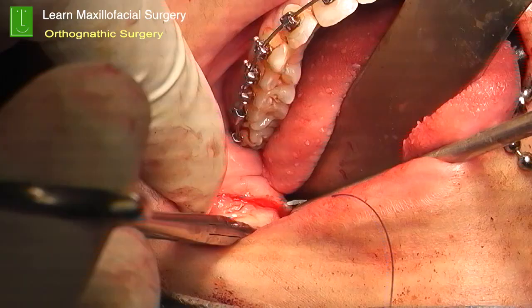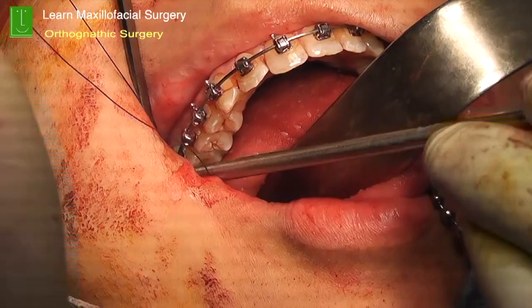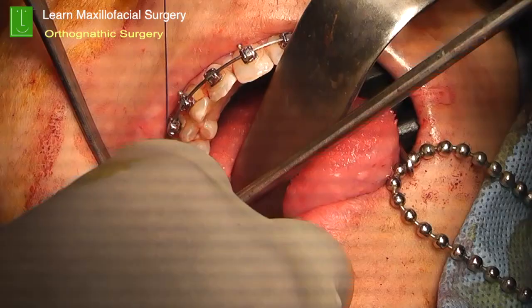Once you are happy with that, then essentially you bring the soft tissues together. The bone has already been fixed with the plates. Now we are bringing the soft tissue together, and as far as possible try to get a nice watertight closure, right?